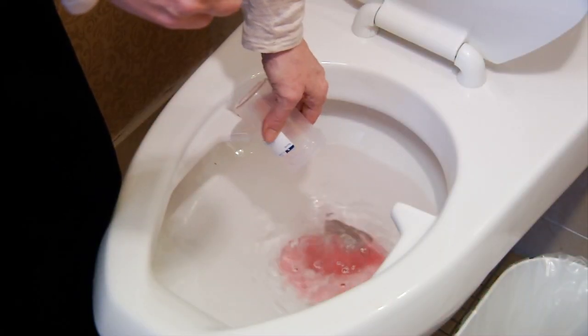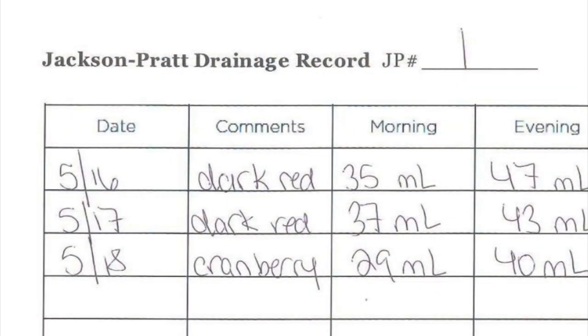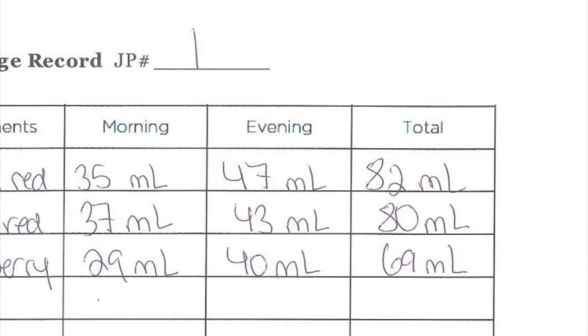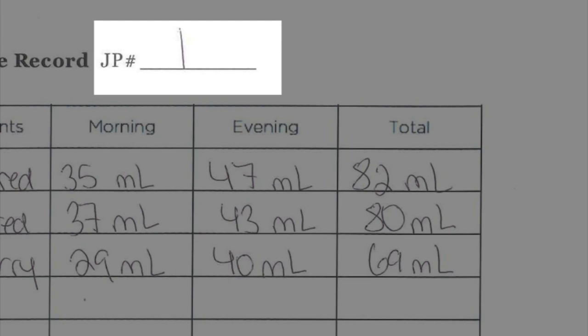Empty the drainage down the toilet and rinse the measuring container with water. At the end of every day, add the amount of drainage for the 24-hour period and write it down. Remember, each drain should be recorded separately.